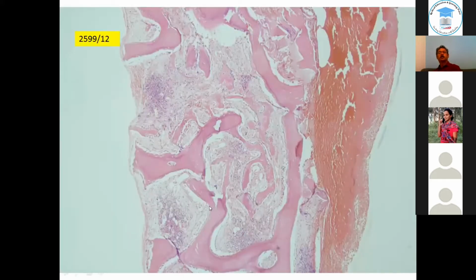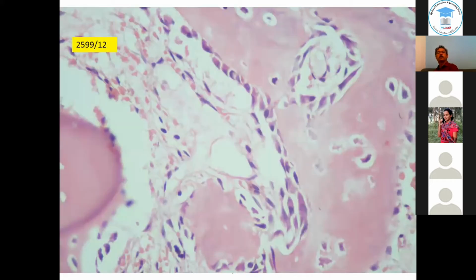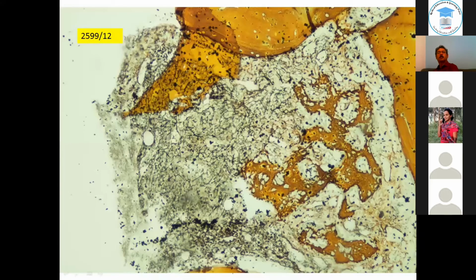And when you look at the trephine, you can see some hematopoietic cells out here, some again out here, but not over most of it. What can you see? You can see some kind of what may be fibrosis. Again, some hematopoietic cells. Here are dilated sinusoids, which is very important for this. You can see some kind of streaming pattern out here, and yes, this does look like fibrosis. You can see prominent osteoblastic rimming in this marrow. Again, osteoblastic rimming, a dilated sinusoid, and the reticulin shows at least grade 2 to perhaps grade 3 fibrosis, and this was a case of myelofibrosis.